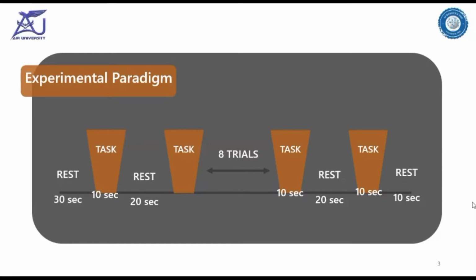We had no cue for the subjects to perform any motion. We just wanted them to perform a motion, and it can be any motion, not even the defined 6 motions, so we can have a broader idea of how the fNIRS intentions will come off, as no work has been done yet with fNIRS, non-invasively, for transhumeral amputees.